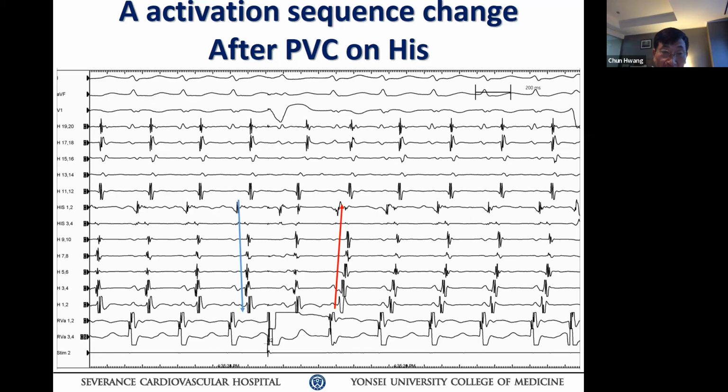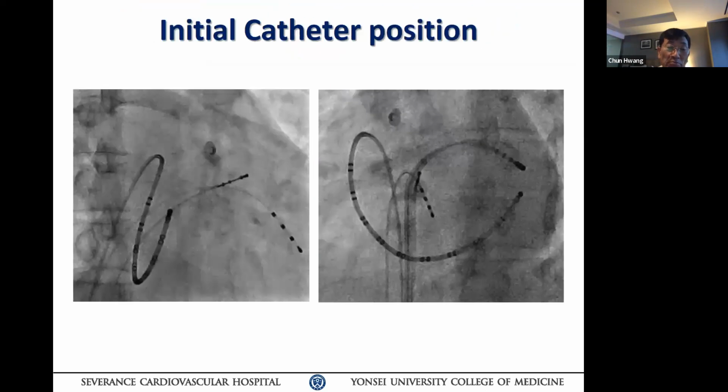Now, take a look at your duodeca catheter position in the X-ray, please show it to me. Your duodeca catheter placement is fairly advanced in the CS into the left lateral, which is very good. But look at the distance from that RV catheter.